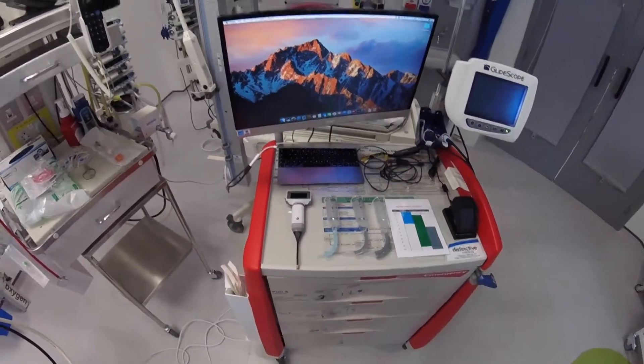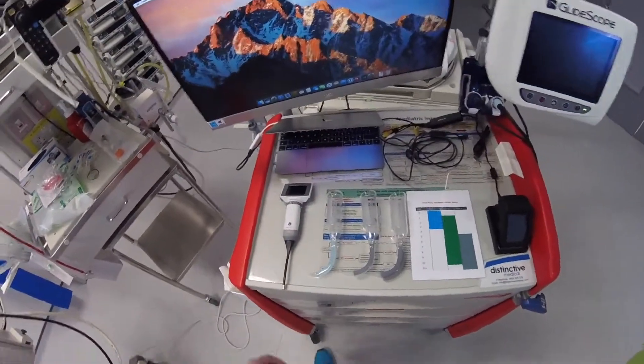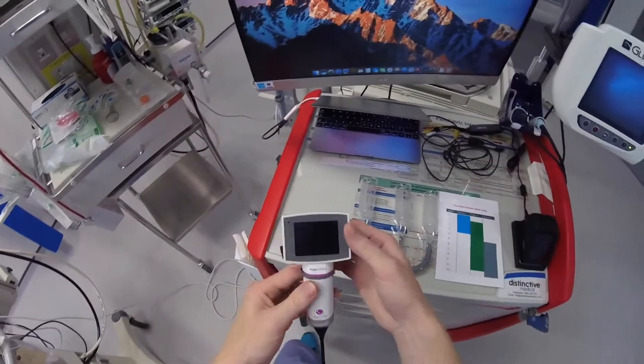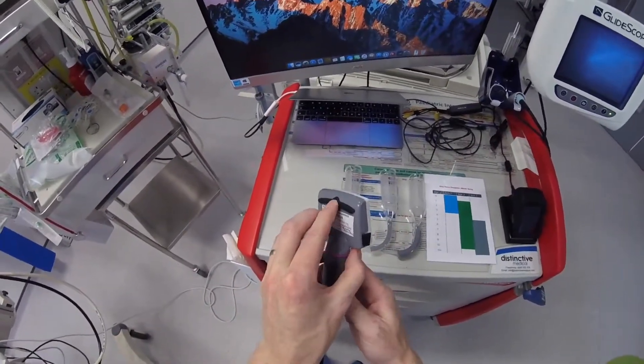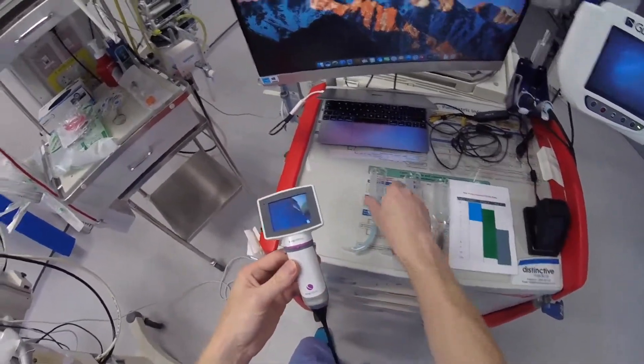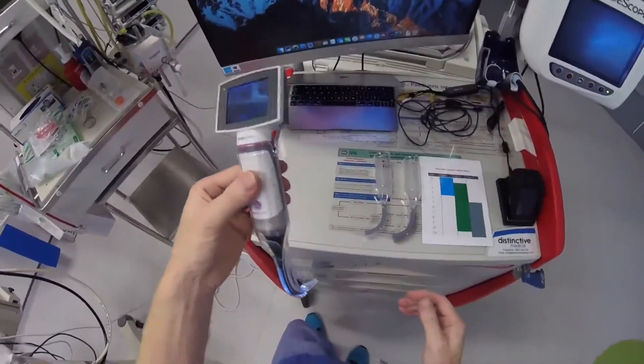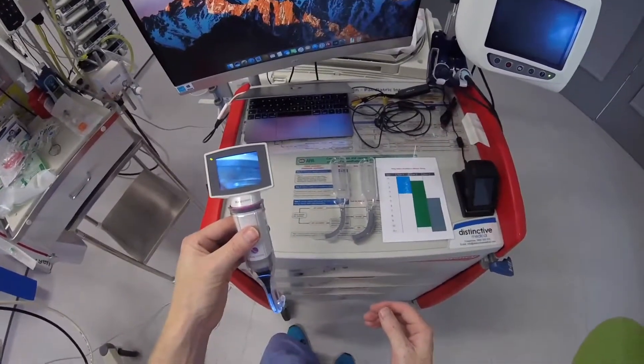I want to give you a quick demo of the KeenVision Paediatric A-Blade. So we've got the video monitor here, and to turn it on, it's just the button on the back. This just slips into the A-Blade, locks into place, and you're ready to go.